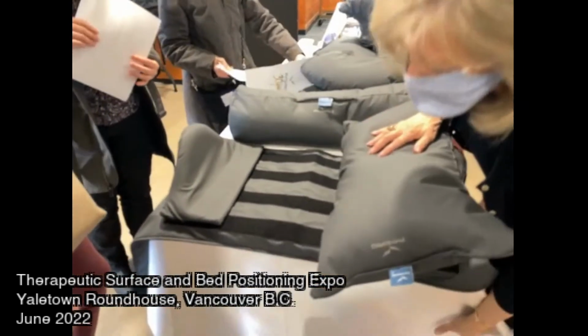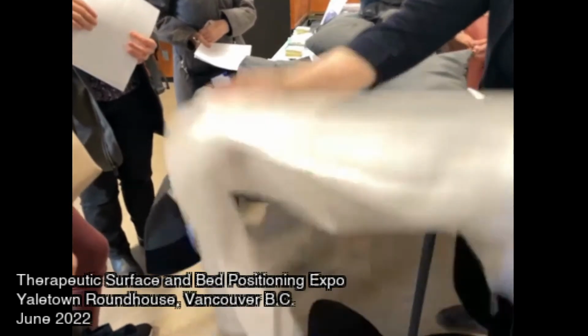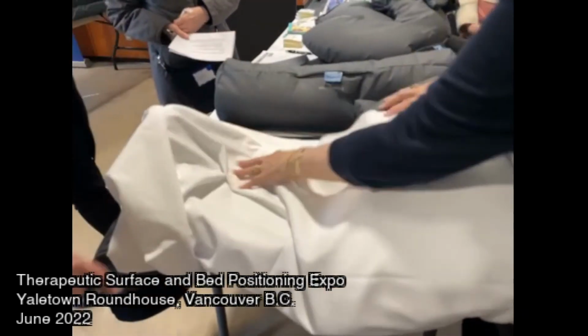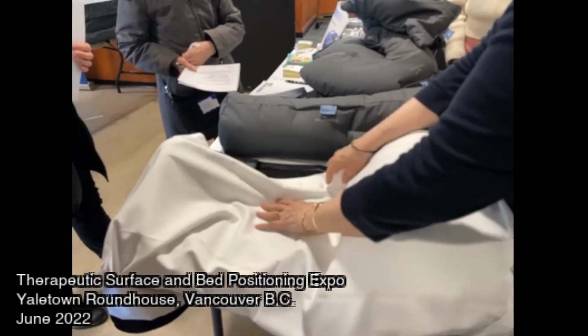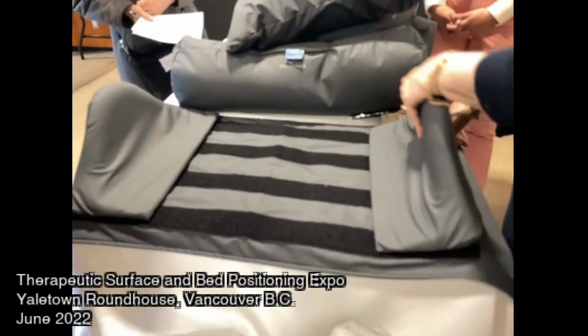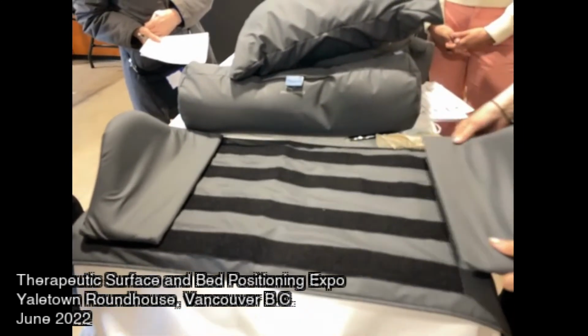and then the nice thing is you can put the sheet right over it, so then you have all the positioning pieces and the sheet is over and the client lies on the sheet as normal. The good thing is that depending on the situation you can move this in or closer or further back.